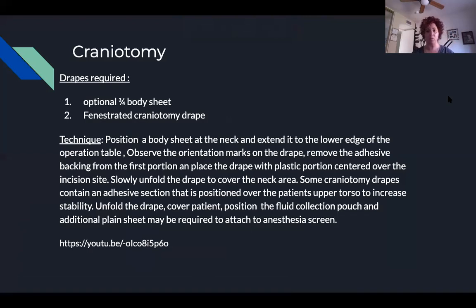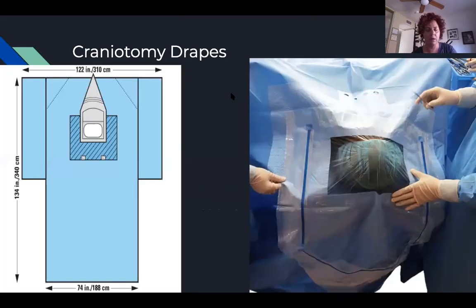When you're draping, you want to come straight out from your table and then just let that drape go and let it fall. Remember how I said, hover, don't place, when we were doing catheters and getting too close to something that's not sterile, or going down below our sterile zone, which is our mid-chest, our chest to waist. So we just want to keep that in mind when we're draping and not follow that drape down out of that area. All right.